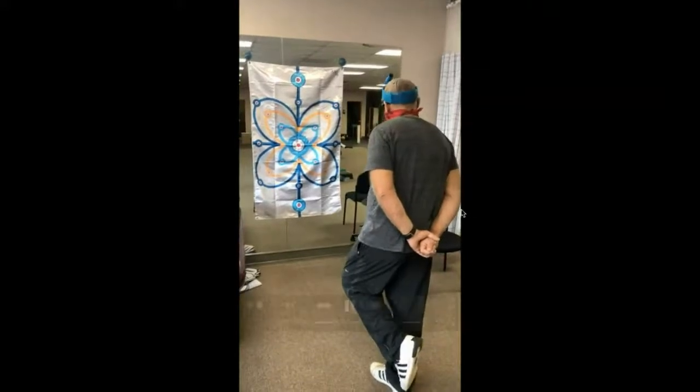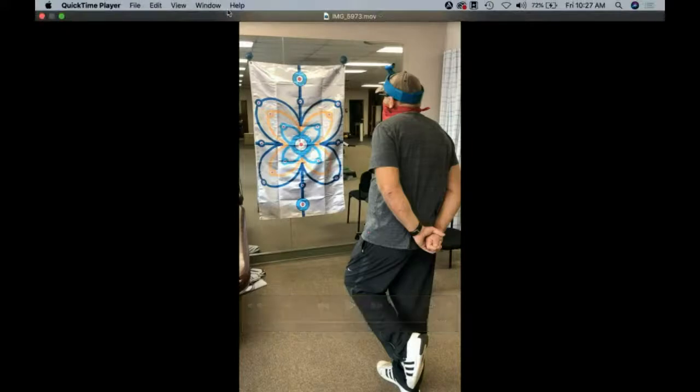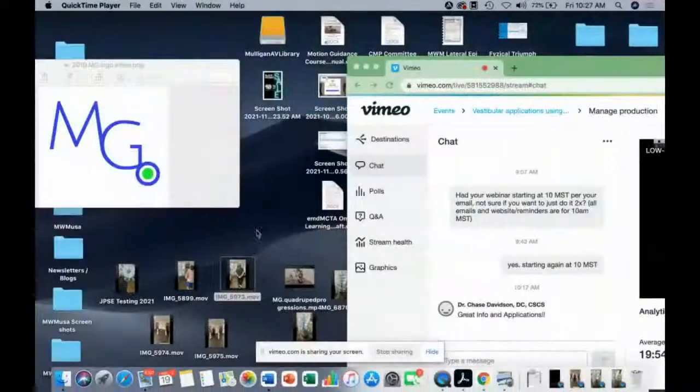Okay, so that gives us some indication by seeing that immediate visual feedback. We got some things that we got to work on in this position down here to retrain. So I'll probably take them through different size excursions. I'll have them go through different extremes of right rotation to really drive home that right cerebellar activity with the cervical spine, and have them go through those control patterns over in this lower quadrant, based on what we saw with just the simple visual feedback assessment there for us.